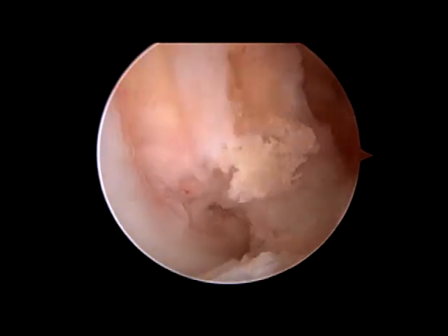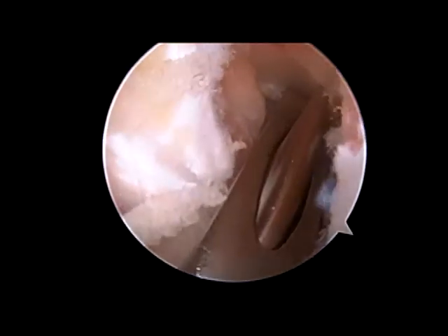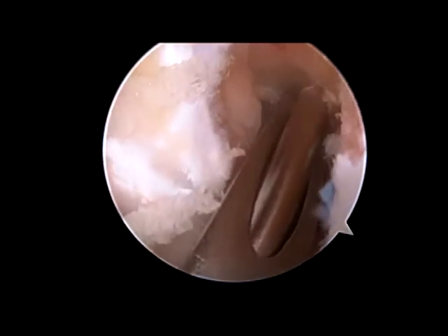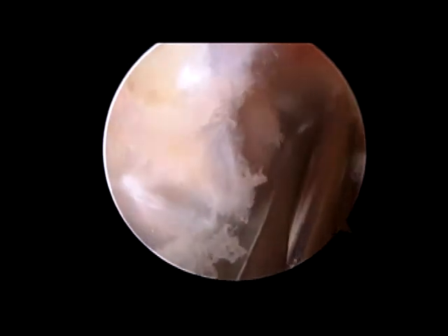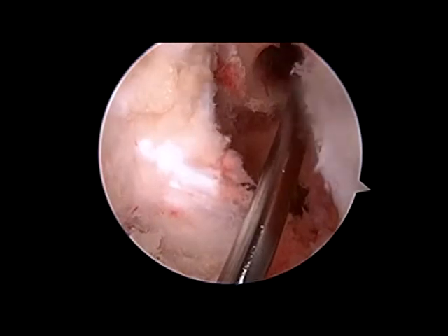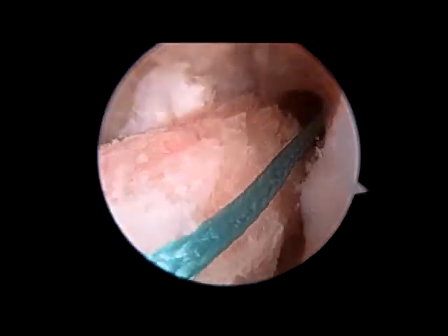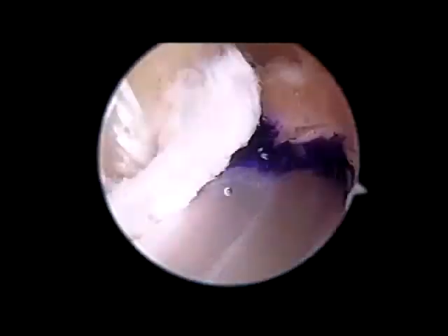A second drill is then passed over the guide wire to create a large 10 mm hole. That hole is then cleaned and prepared so a femoral guide can be hooked over the back of the femoral condyle, and a guide wire is then drilled through the femur and out the side of the thigh. This is over-drilled to create a second hole with the guide wire in place. The guide wire is pulled through the knee, bringing sutures with it.